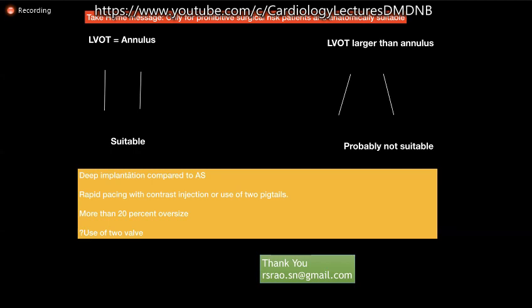Rapid pacing with contrast injection to outline the entire annulus, or use of two pigtails, is more important. The valve oversizing should be more than 20%. Sometimes, rarely, two valves can be used. So thank you very much for your kind attention. The remaining questions or issues we can discuss if there are any.